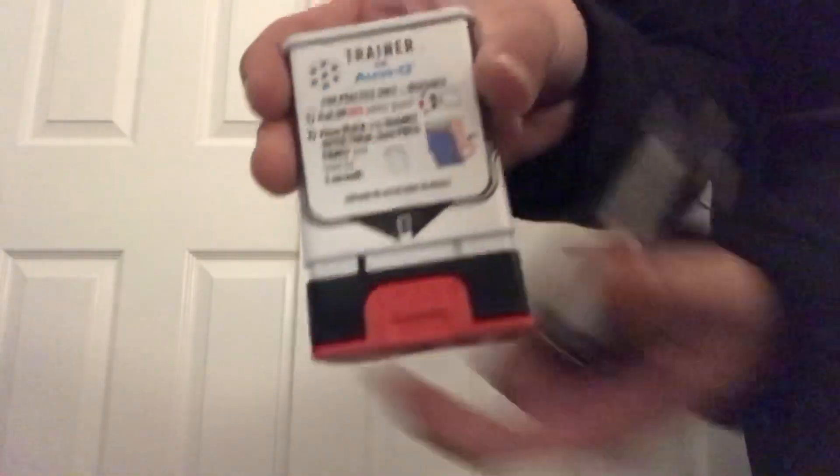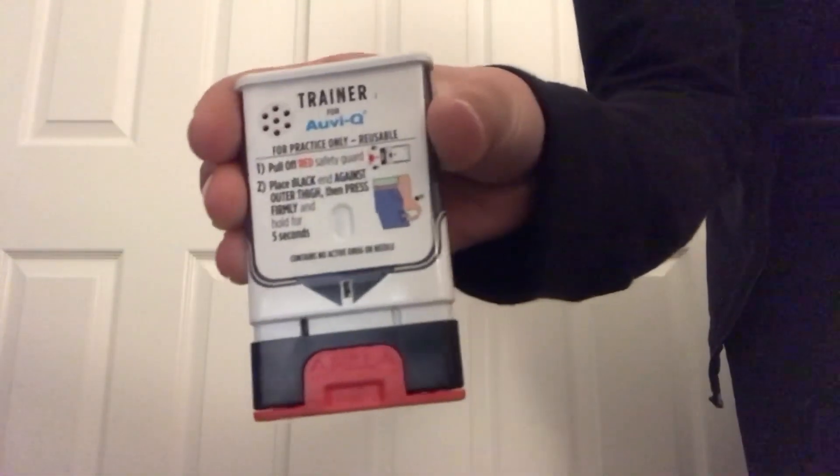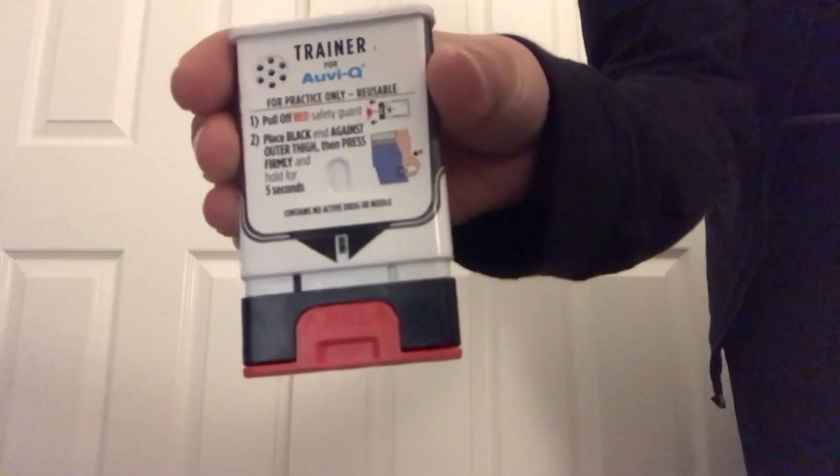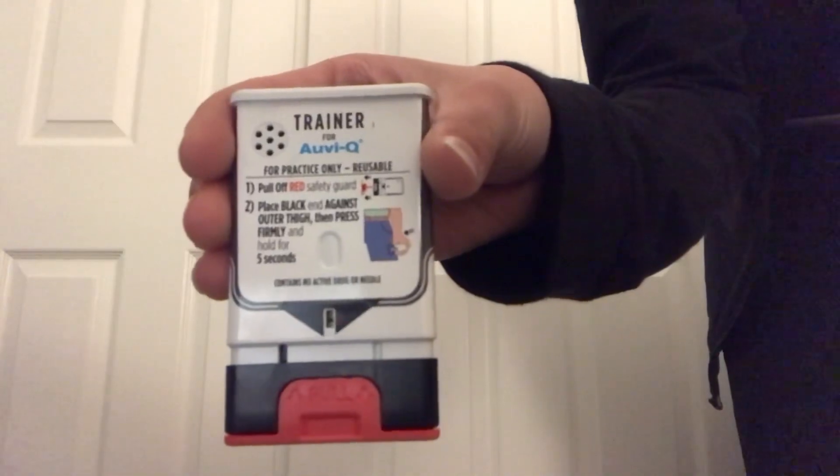This trainer contains no needle or drug. If you are ready to use, pull off the red safety guard.